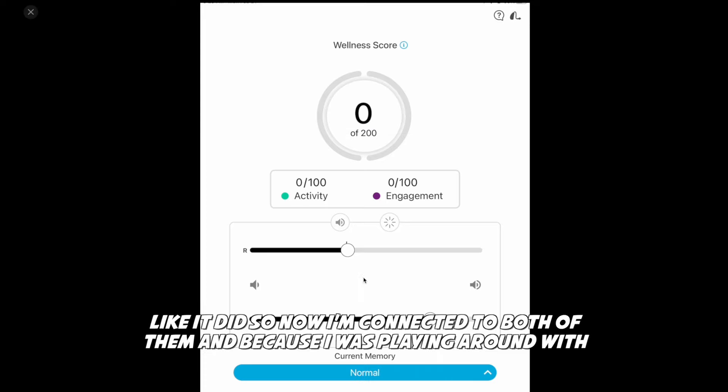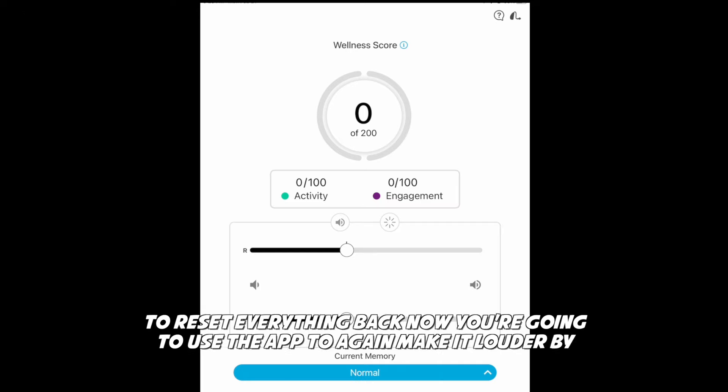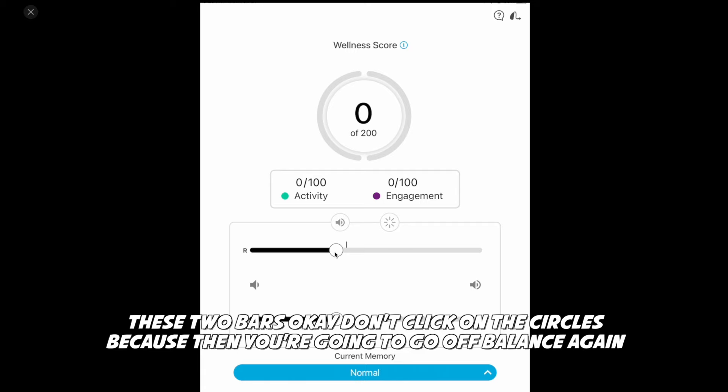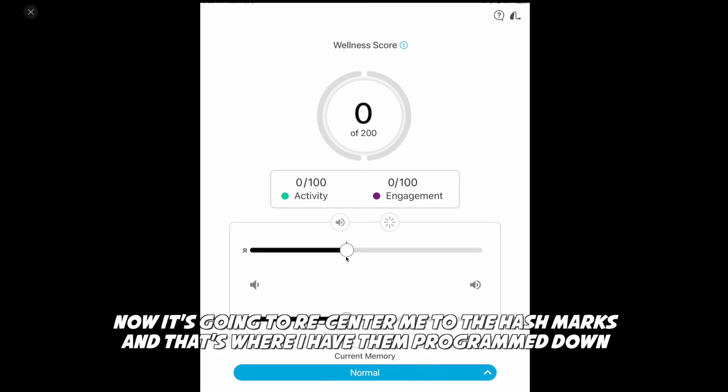Because I was playing around with it, you can see I'm off — not at the same level. So double tap here in the middle and it's going to reset everything back. Now you're going to use the app to make it louder by clicking and dragging between these two bars. Don't click on the circles because then you're going to go off balance again — click in the middle. If you're off balance, double tap and it's going to recenter you to the hash marks where they're programmed.